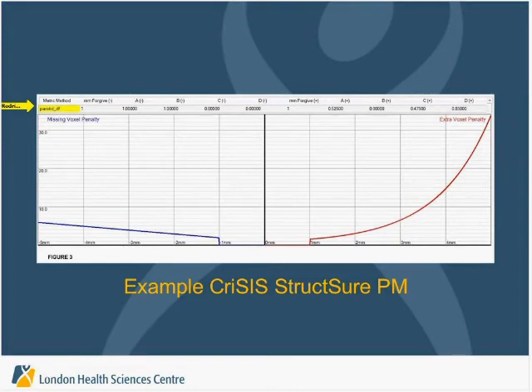And as it was over-contoured, we put an ever-growing exponential penalty. One of the discussions we had was that we didn't like under-contouring because we didn't want hot spots left in the organ at risk, but also we didn't want people to over-contour significantly because that would drive your DVH down, and there might be problems with IMRT optimization.